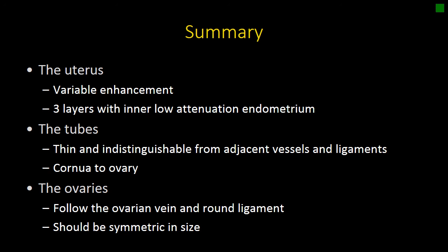In summary, the uterus is a challenging organ to evaluate because of its variable enhancement. Familiarize yourself with the variants of normal so you can recognize abnormalities. Remember that the uterus has three layers and that the inner layer on CT is low attenuation and shouldn't be mistaken for fluid. The fallopian tubes are often hard to see — they tend to be indistinguishable from the mesovarian vessels and adjacent ligaments, but they always extend from the uterine cornua to the ovary. When looking for the ovaries, use the ovarian vein and round ligament to triangulate their location, and make sure to evaluate their size and for the presence of any complex lesions.